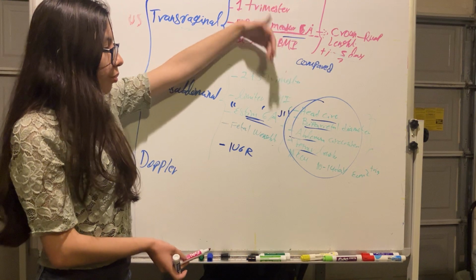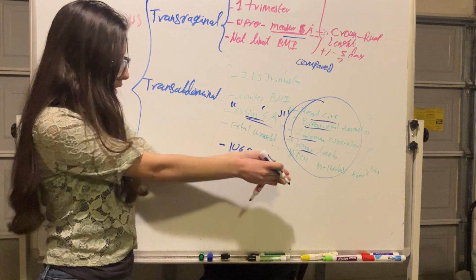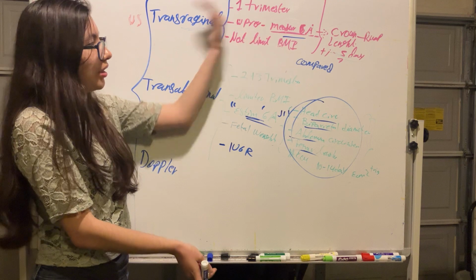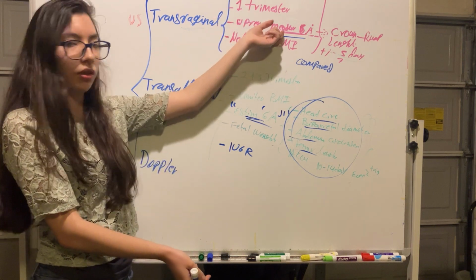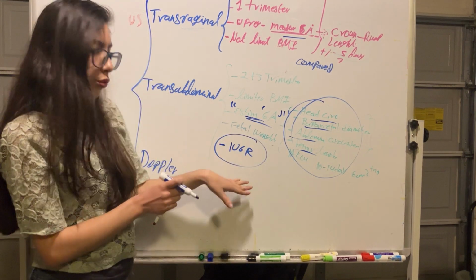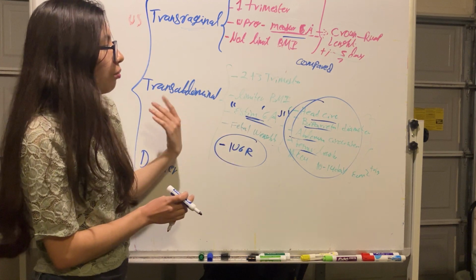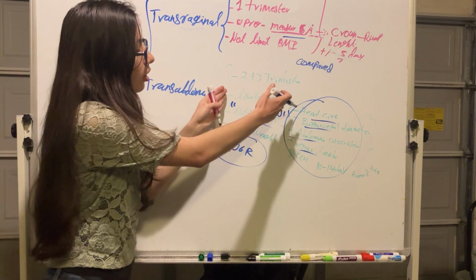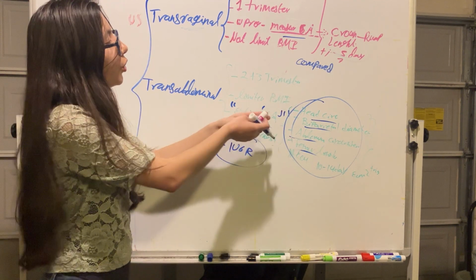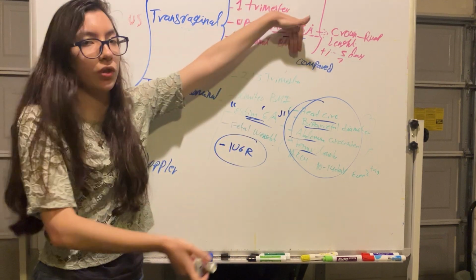And this is important because comparing this estimated gestational age at this point with the established gestational age during the first trimester is what gives us a clue for intrauterine growth restriction. So that comparison is important. Most of the time this estimated gestational age during each ultrasound corresponds to the already established measurement of gestational age.